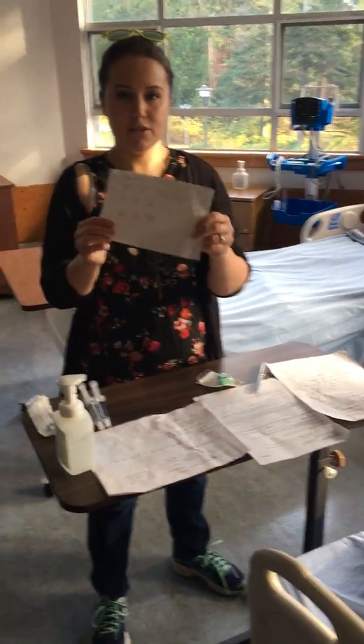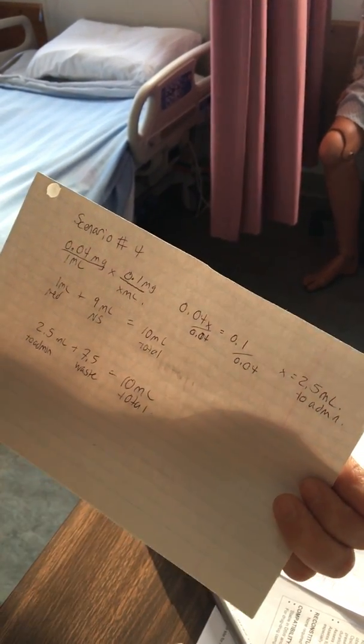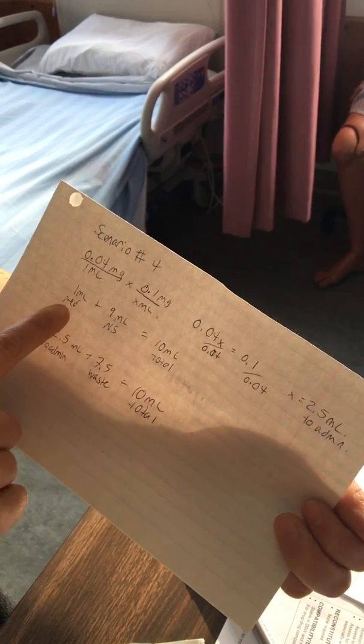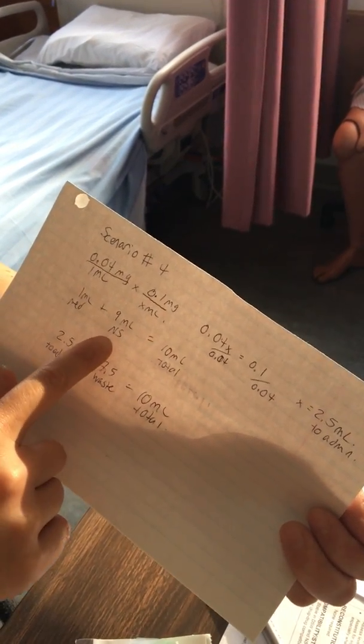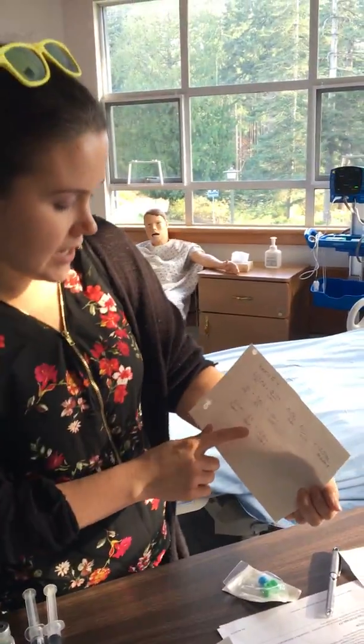I'm doing my math to show that I've calculated that with her dose that's ordered of 0.1, I need to be giving 2.5 milliliters. And so that's 1 milliliter of med, 9 normal saline for a total of 10, wastes 7.5 because I'm going to give 2.5 once it's diluted.